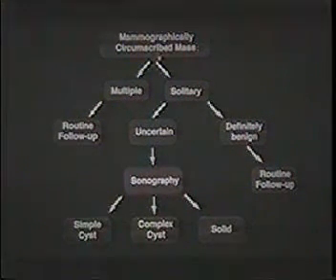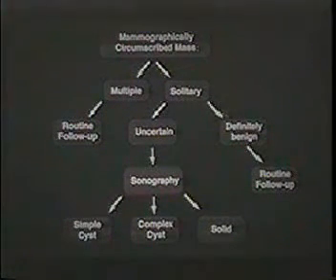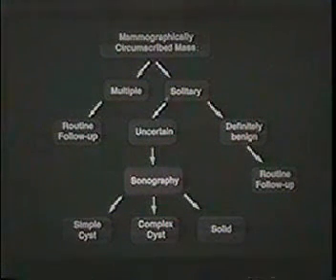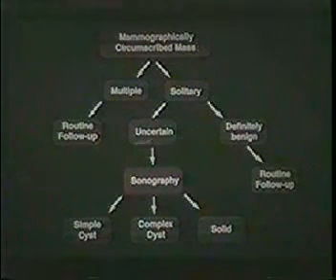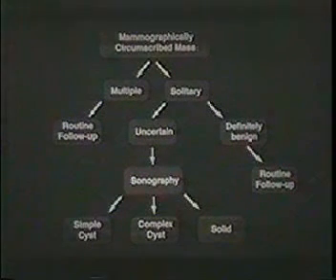However, if the circumscribed mass is solitary, then mammography may show that it's definitely benign, which requires no workup, and that would be cases that Dr. Dershaw mentioned, which would be those that contain fat, those that have typical calcifications. If it's uncertain as to what the nature of the mass is, it should go to ultrasound. And the sonogram should show either a simple cyst, a complex cyst, or a solid mass.